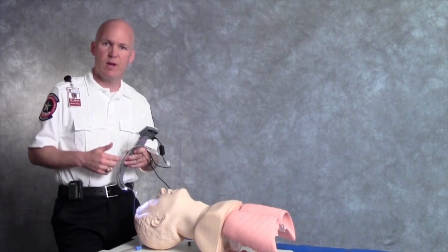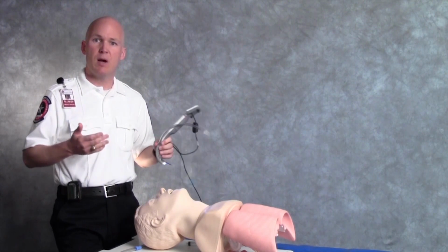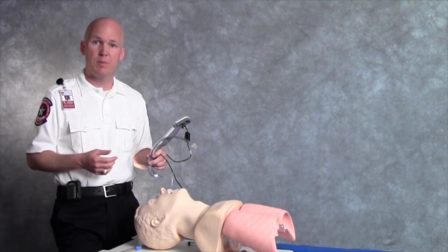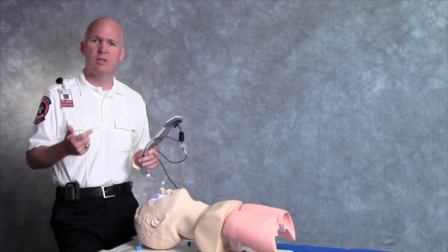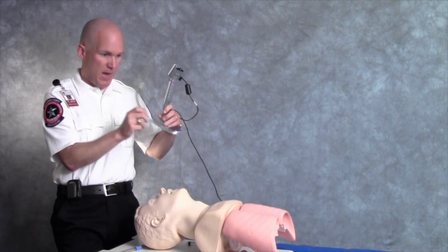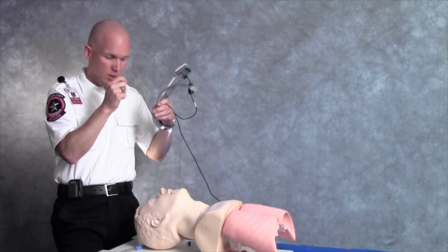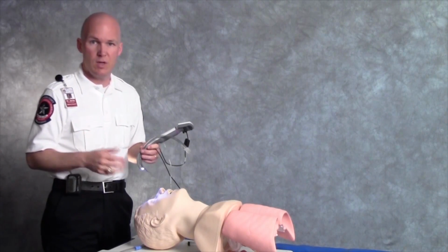Now, the other benefit we found with preloading the tube like this is that it frees up our right hand to use with suctioning. We can now suction simultaneously while intubating, and have found this to be a big help. With direct laryngoscopy, it's very difficult to intubate and suction simultaneously, for two reasons. First, your right hand is busy trying to pass and guide and direct the tube. And second, because you need that direct line of sight, the suction catheter is obstructing your view of the cords. So let me demonstrate how this isn't the case with the King Vision.